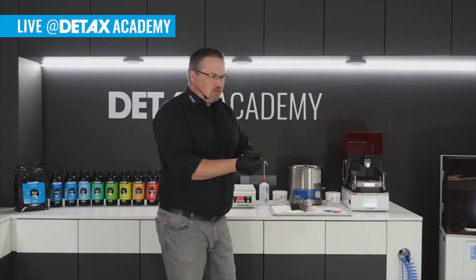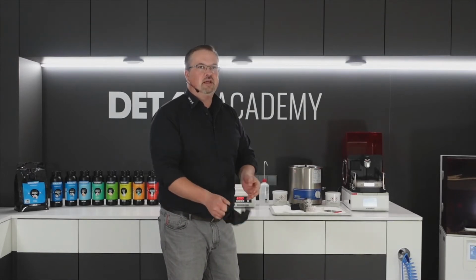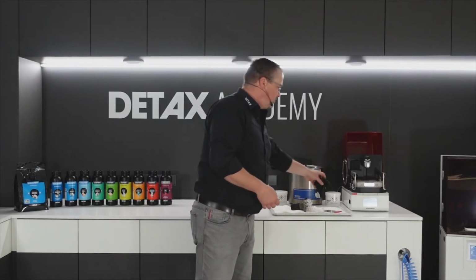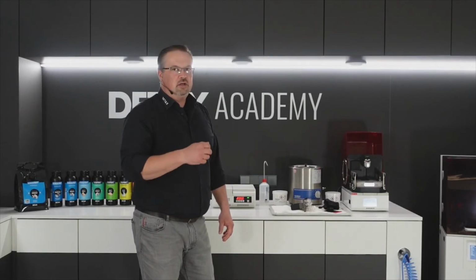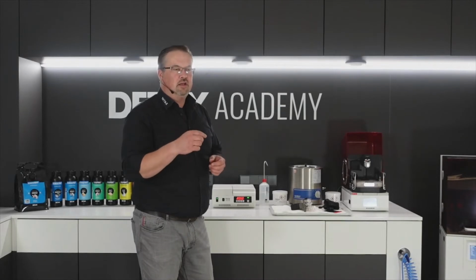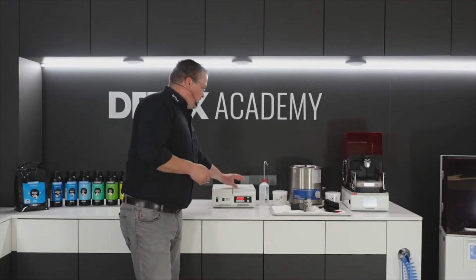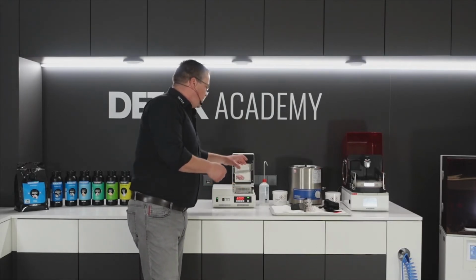After that, also, please make sure it is completely dried. So it is dry inside. There's no isopropanol alcohol longer inside, because if you cure it finally later, you will get some white areas, and then you know it is not perfect clean or dry. We cure it with the Auto Flash. It's also possible with other curing devices.